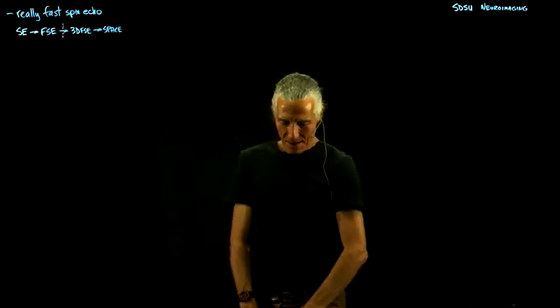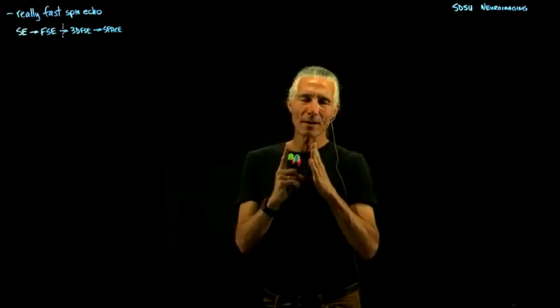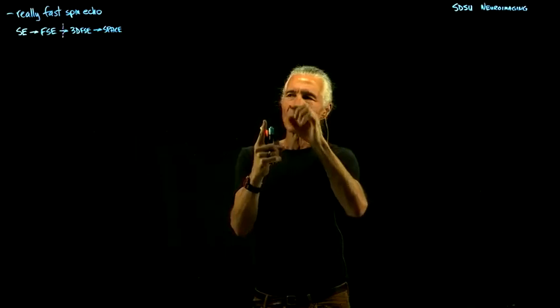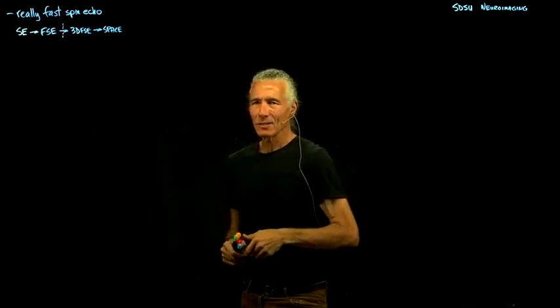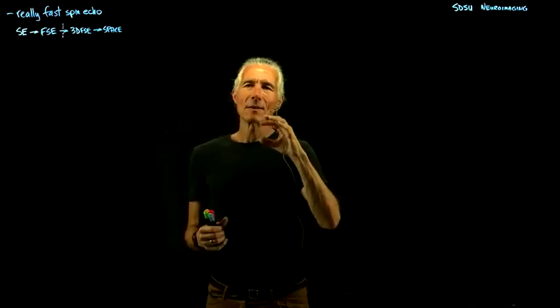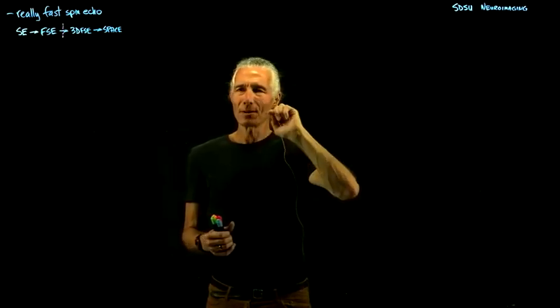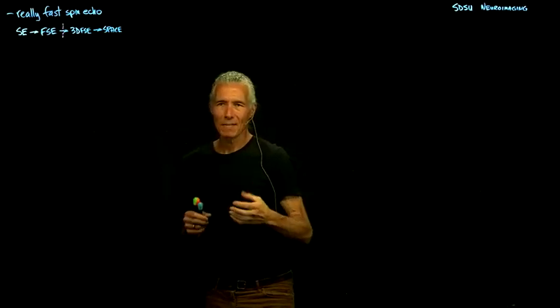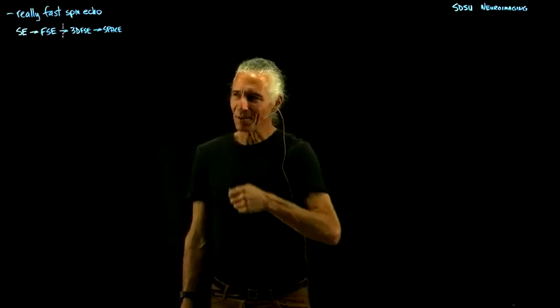So one of the problems we said with collecting slices is that there's a limit on how thin you can go on the slices. So you can make an image that has a lot of pixels looking down on the slice, but the slice is pretty thick. And it's nice to have pixels that are the same dimensions in all the axes, because otherwise you get a bias depending on what direction your slices have been recorded in. So the image will only be blurred in one axis, but it won't be blurry in the other axis. So it's kind of a strange effect. That doesn't normally happen out in the real world when you're looking or cutting into an object.